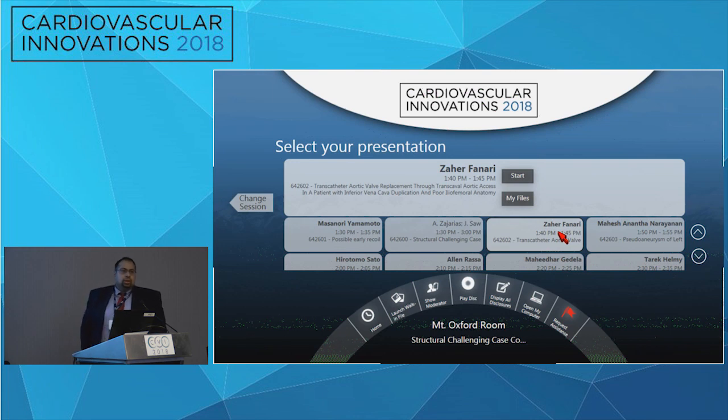Number two, your strategy of going relatively low in the aorta, he told us that you basically don't really have a bailout because there's no stent that really fits. How would you have saved that situation? So he said that if you don't have enough landing zone in the aorta above the bifurcation, you might get into trouble. So he doesn't like the lower sticks that you chose there.